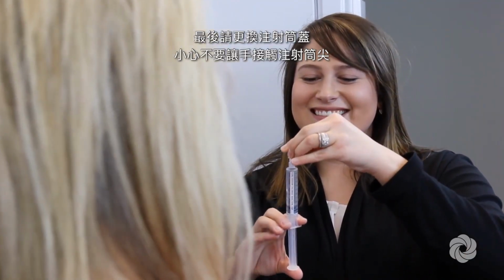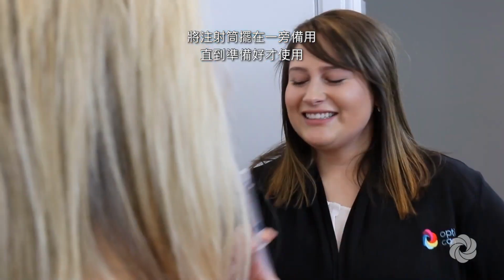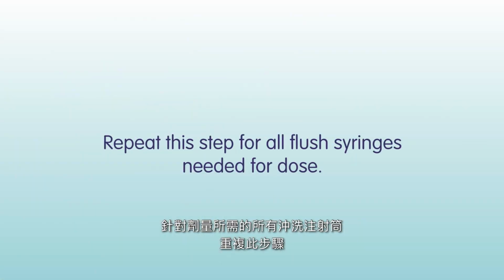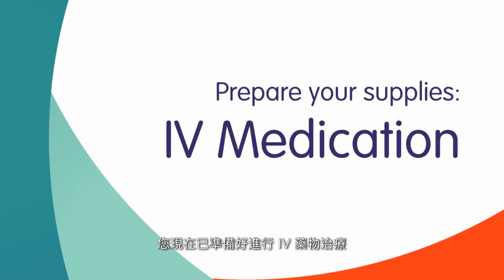Finally, replace the syringe cap, being careful not to touch the tip of the syringe with your hand. If you touch it, you will need to start over with a clean syringe. Set aside the syringes until you are ready to use them. Repeat this step for all flush syringes needed for dose. You are now ready to prepare your IV medication.